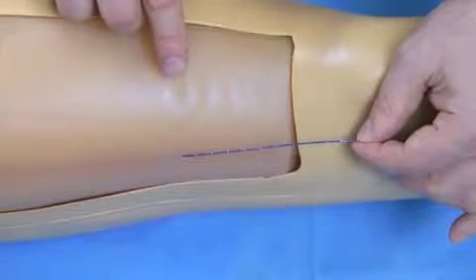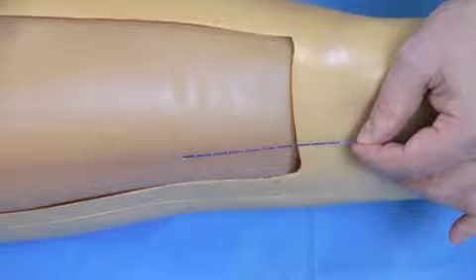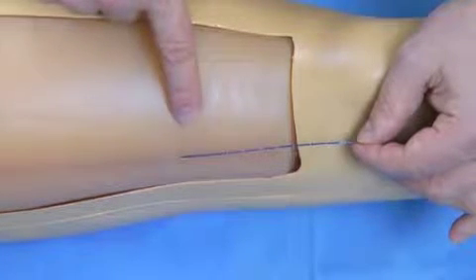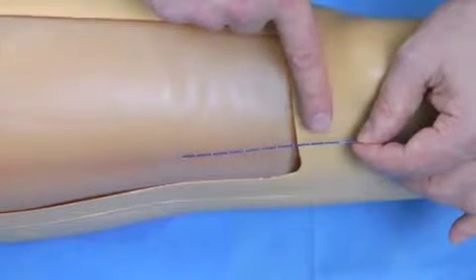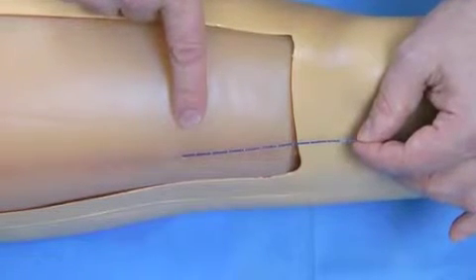Once we're in this position, we can then use the ultrasound to show that the tip of the Never Touch Direct fibre is two centimetres back from the sapheno-femoral junction. And so we can then measure here, and measure against the number of markings, so we can mark down exactly where we are at that position.